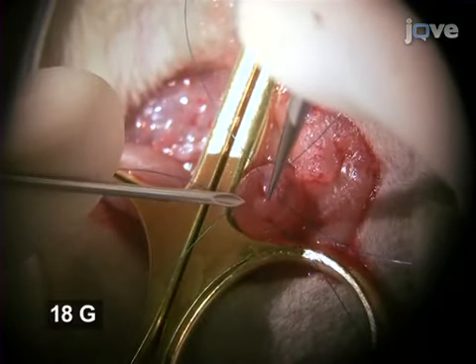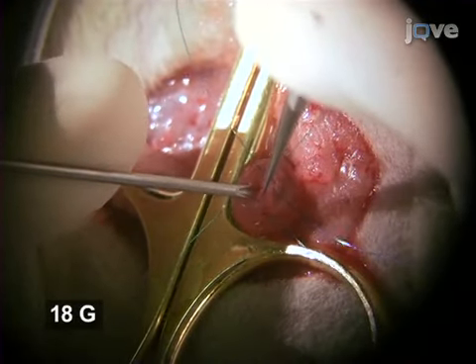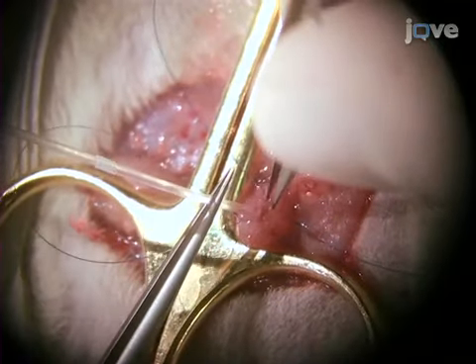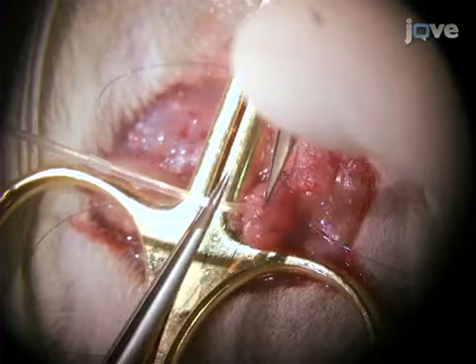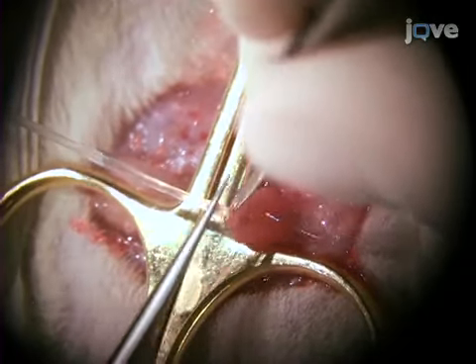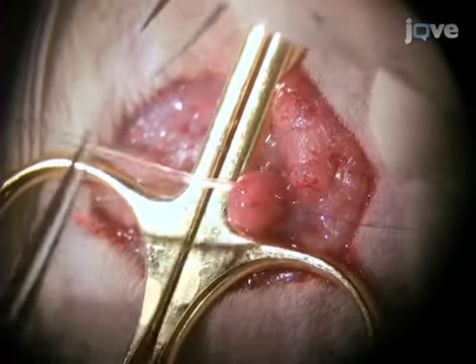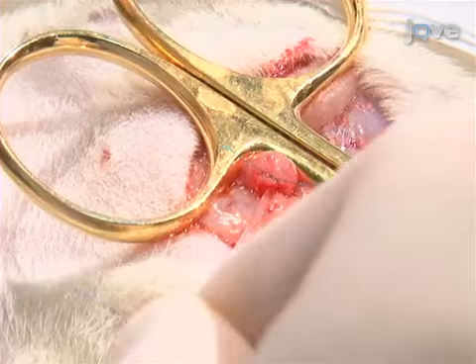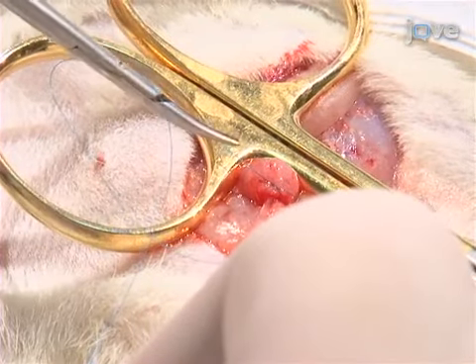Next, using a needle, perform a small cystostomy inside the purse string. Insert the cuffed PE50 catheter through this hole. Thinner catheter tubes, like PE10, can have a higher and more variable resistance, so they are not recommended. Secure the purse string around the tube using a surgeon's knot.